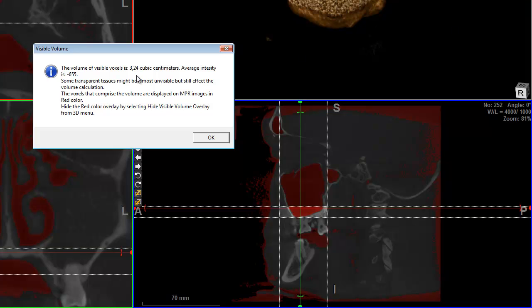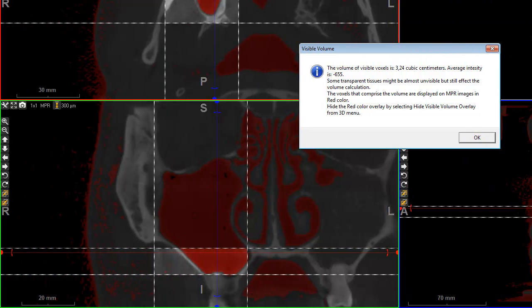You get 3.2 cc of biomaterial. In case you want to be sure about what you're looking at, everything in red is the 2D volume being calculated, and you can see it clearly in 3D as well. We defined the windowing with airways for air, so we told the software we are looking for air, and that's what it's calculating. This was volume calculation dedicated for sinus lift with WhiteFox Imaging.